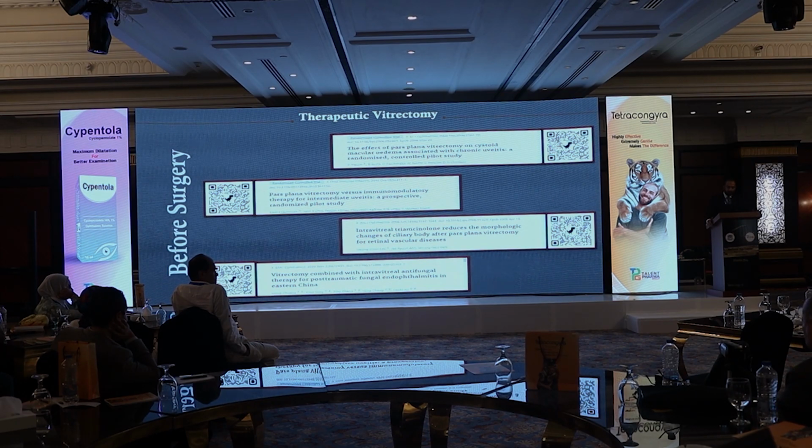And at the end, we can use, of course, intravitreal triamcinolone or intravitreal antibiotics accordingly for each of their conditions at the end of the surgery to enhance the results of the surgery.